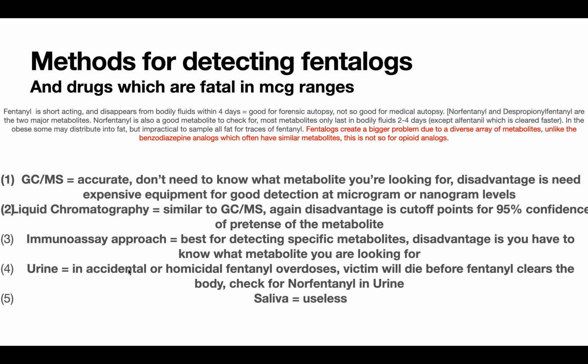Now, in a medical case, if it was administered intrathecally or IV for sedation and anesthesia, that's a different story. But for forensic purposes, you can check the urine. Saliva samples are useless. The immunoassay approach is best for detecting the metabolites.